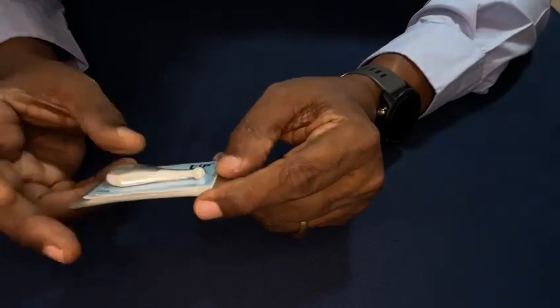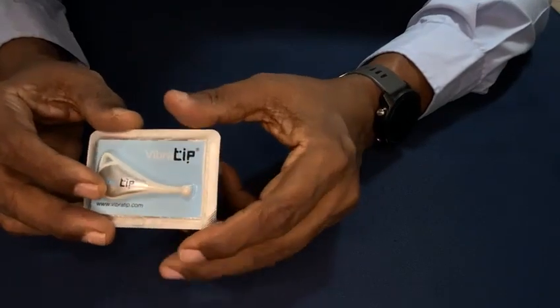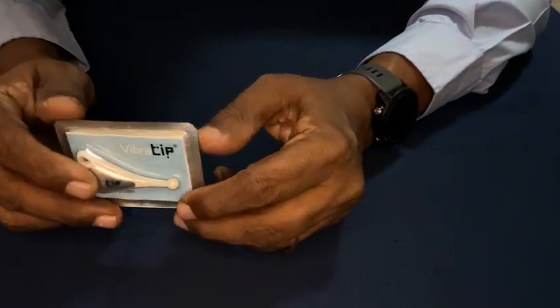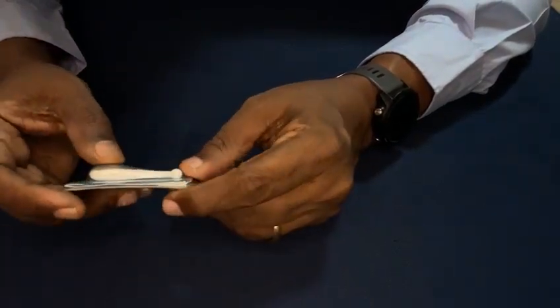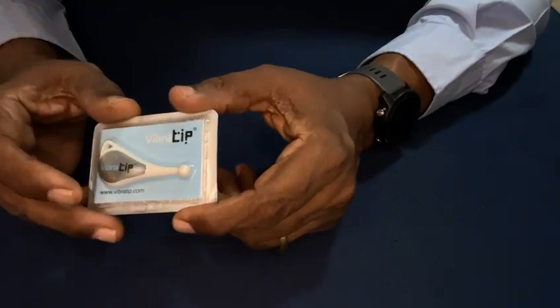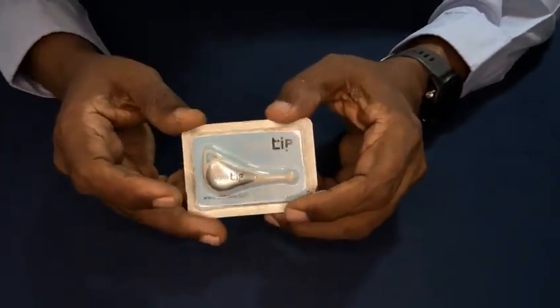When the patient feels the vibration, he is alright. And if he is not feeling the vibration sense, that means he is considered at high risk.